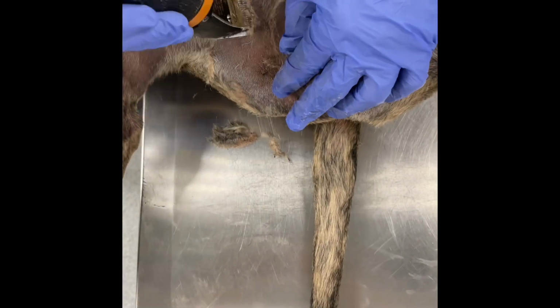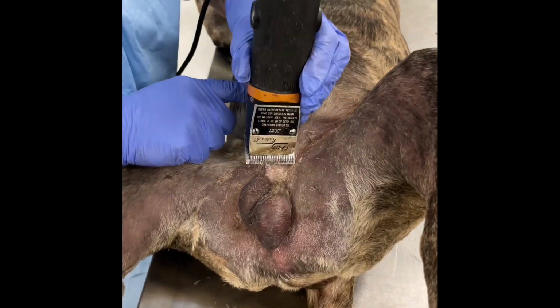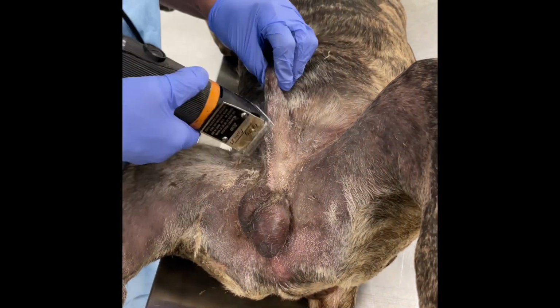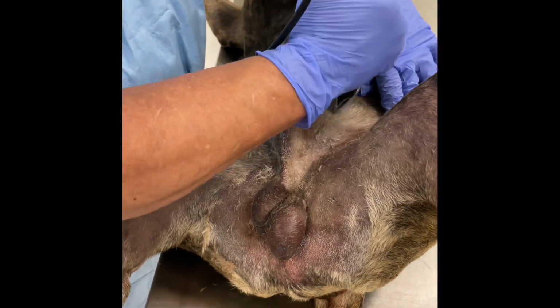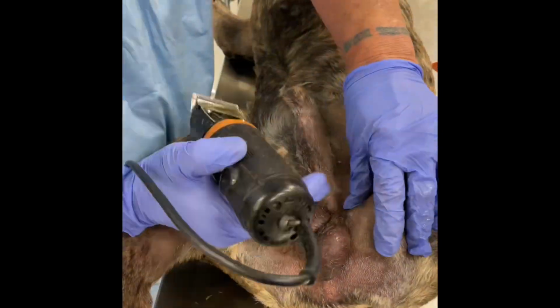When you're shaving the scrotum, you're going to be very, very, very careful because the skin is extremely thin and it's very sensitive. So we're going to be very gentle when we're handling the scrotum. We're also going to be very gentle when we're handling the insides of the thighs.